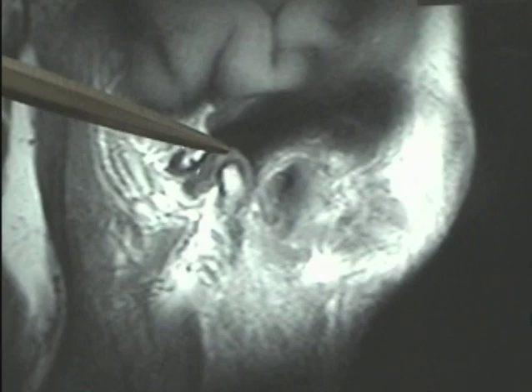The MRIs reveal that the discs within each joint were anteriorly dislocated without reduction. That means they were displaced to the front and did not go back into place upon opening of the mouth. This is why it hurt her to open and why her interincisal opening was limited. Although you may think 46 millimeters was a normal opening, to me it is an impairment of function. The normal opening should be 50 to 54 millimeters, in spite of what you may have been told by other people. So therefore, we now address the internal derangement, and we do this by open joint plication surgery.